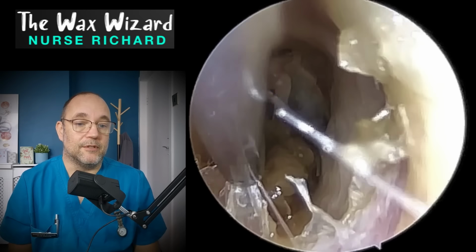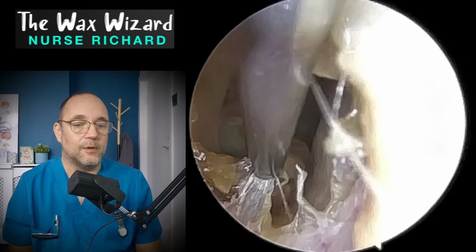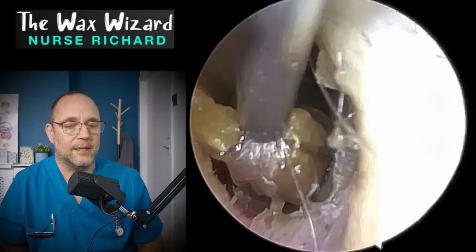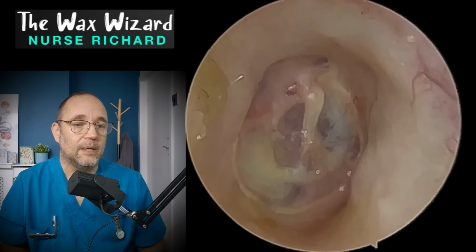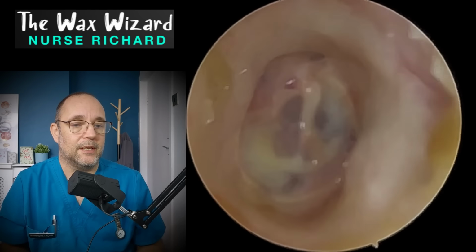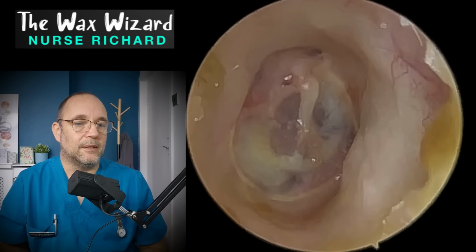She did notice a big difference, obviously. And I do have to refer her onwards to the local ear, nose and throat department just to get that area looked into. And can you see what I mean here when I say the ear canal's a bit bumpy? Just trying to get that in focus there. Empty now, that's the main thing, and she could hear better. And hopefully there's nothing too major going on behind that. I don't suspect it's a huge problem because it was a really small area. You've got to bear in mind how magnified these things are.